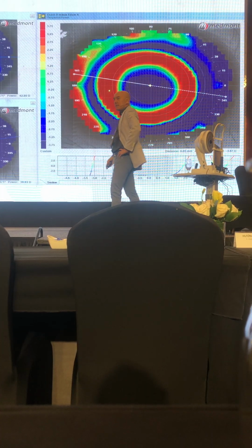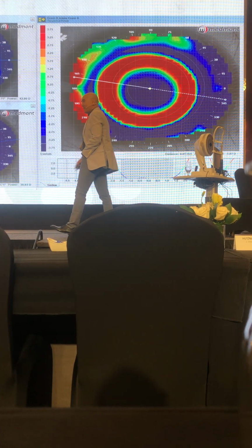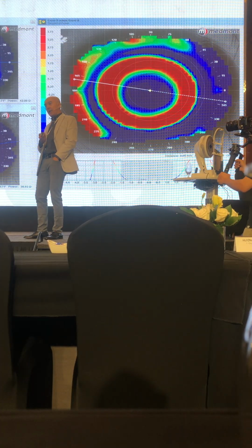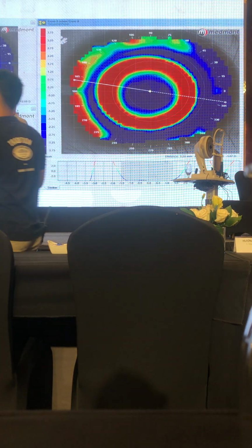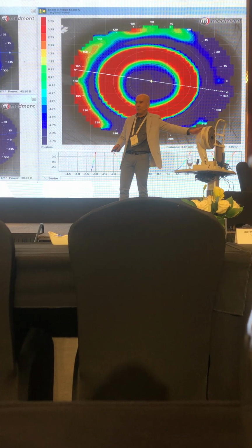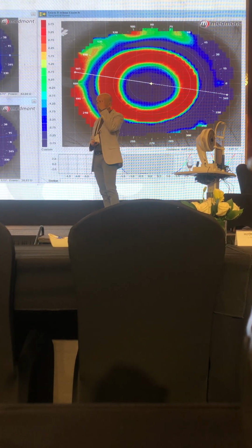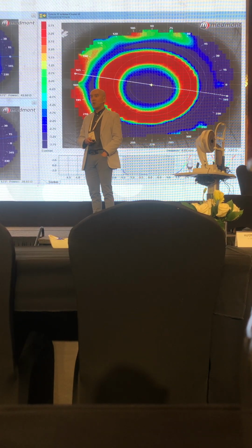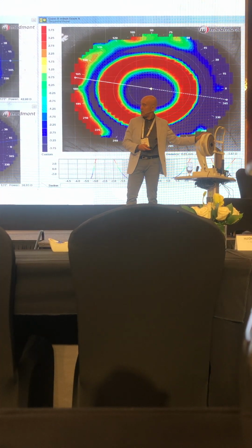Now, some researchers say you have to measure pupil size from the Ortho K machine, from topographers, under scotopic condition and photopic condition. Is it accurate? It depends on what topography you use. If you use the latest Medmont Meridian, basically there's no way because it's really bright, very bright, really hard to tell. And the pupil size is dynamic. So what we can do if you have a Medmont, unfortunately we don't have this piece of expensive machine.